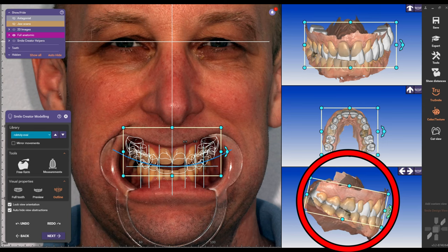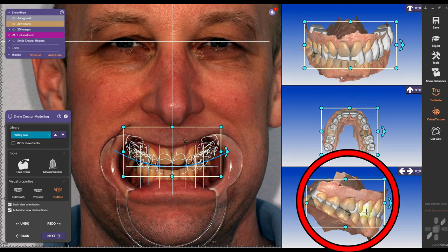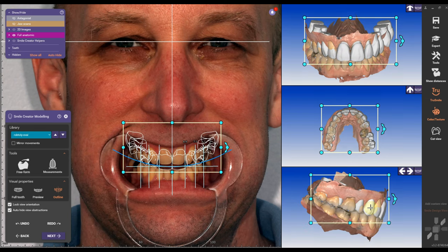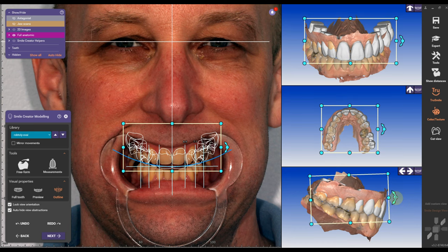To my liking — you might have a different opinion, please leave it in the comment section if you like it or not. I like this library a lot. After I position the library roughly, I can go to my first preview.